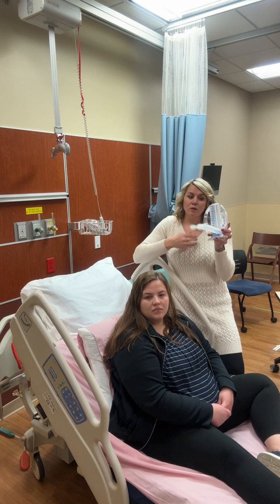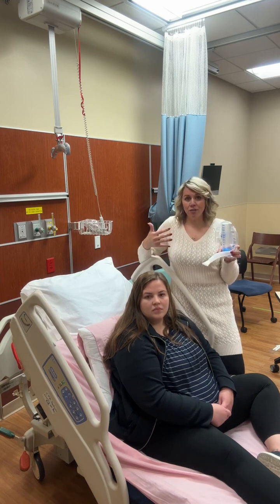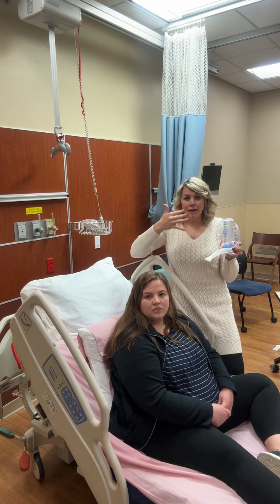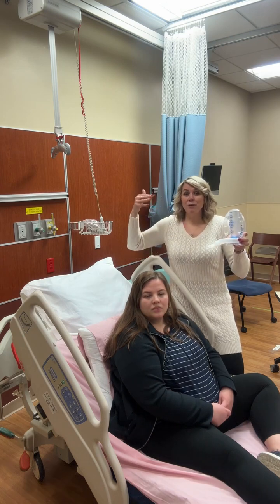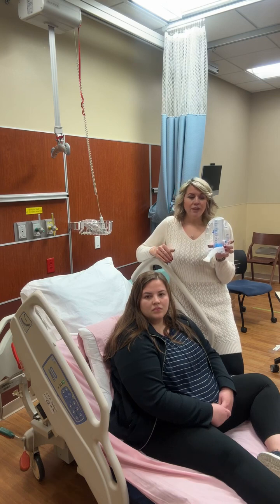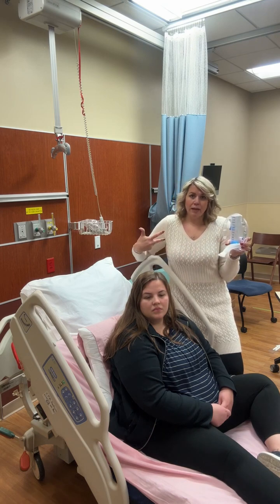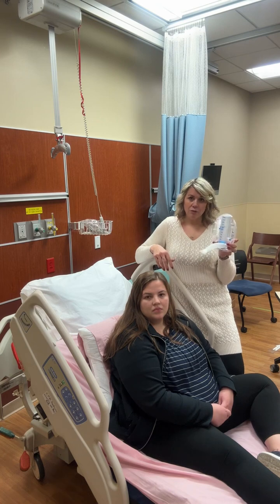Typically, this replaces the yawn reflex. So if you take a nice deep breath and you yawn, you'll do a natural breath hold right at the peak of your inspiration. That is what this is. And it's hard to do that if you're in pain or if you have pneumonia and there's fluid in your lungs. It's hard to expand. So that's what this replaces.